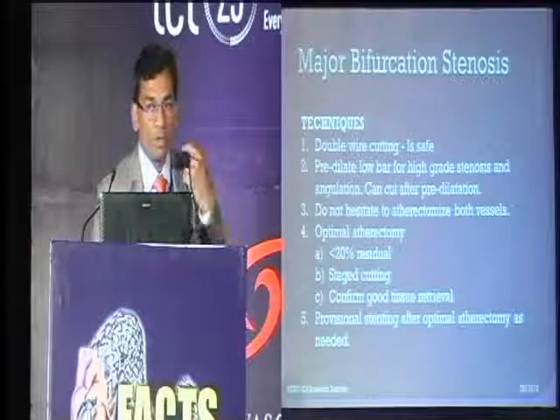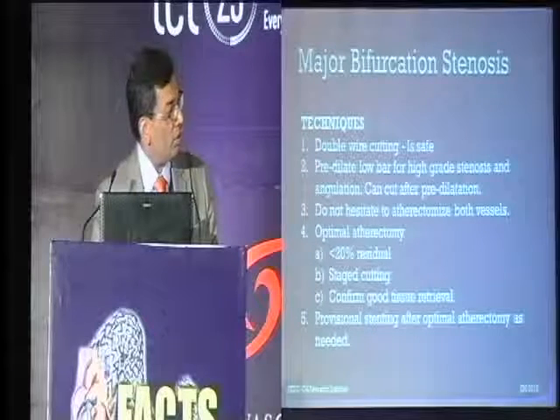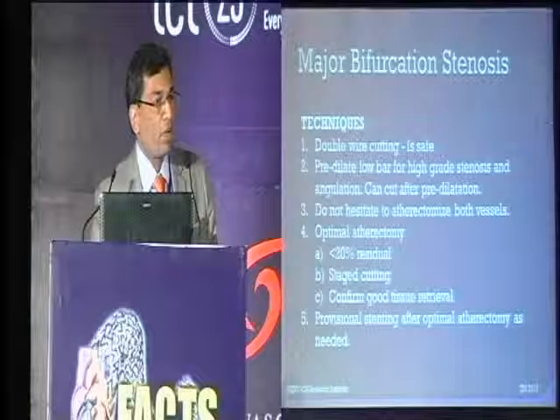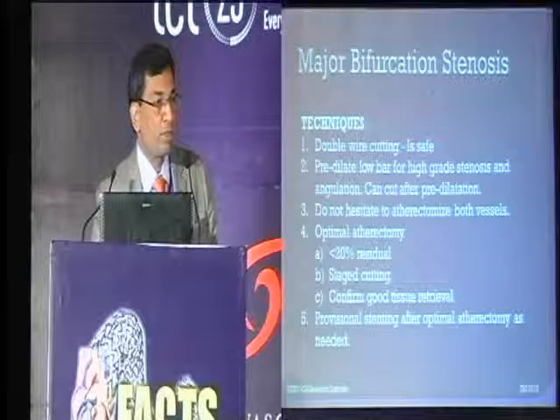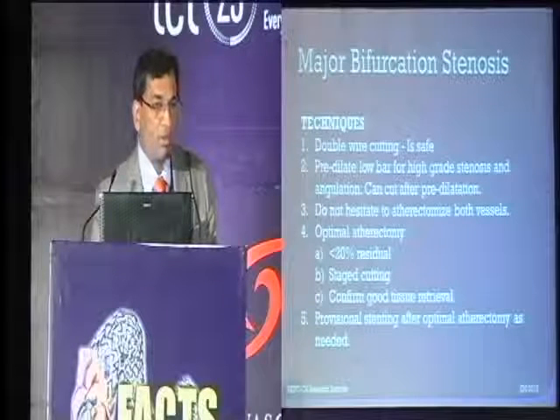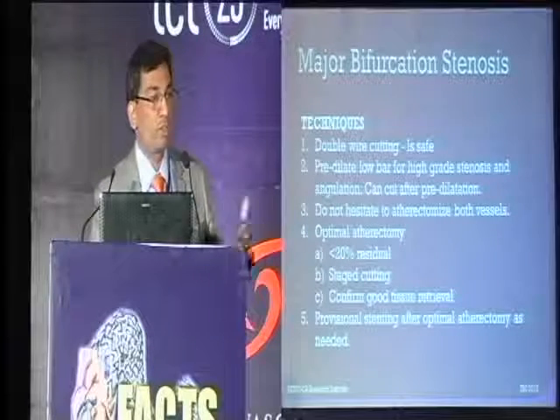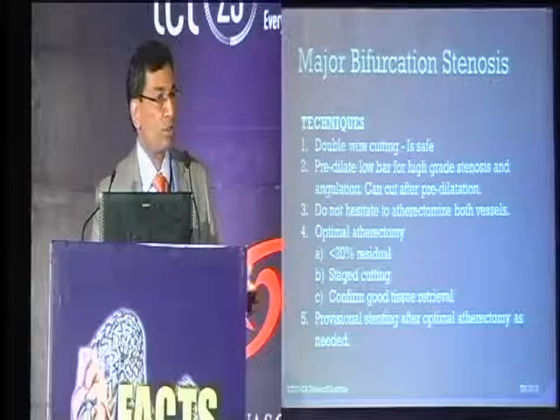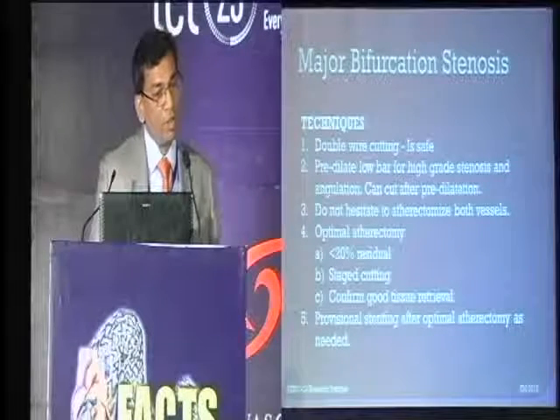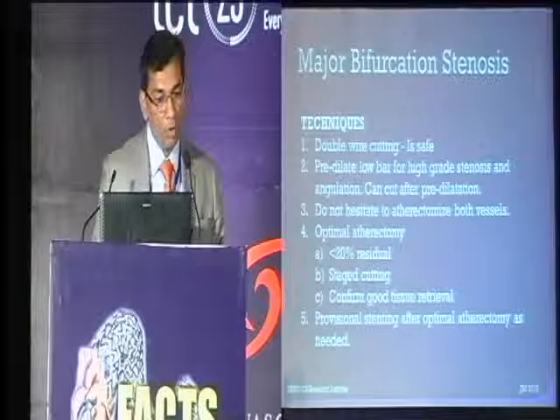If you remember, the atherectomy trials in the history of angioplasty, including the old BOAT trial, were all shown to have a high restenosis rate, and that's why people gave up atherectomy. If you look at sub-analysis of these trials, they left 38 to 42% residual stenosis and then ended up finishing the case using balloons or stents, which is just glorified angioplasty. That's not atherectomy. So if you need to do atherectomy and have good long-term results, you have to commit to the device. That's an important point.